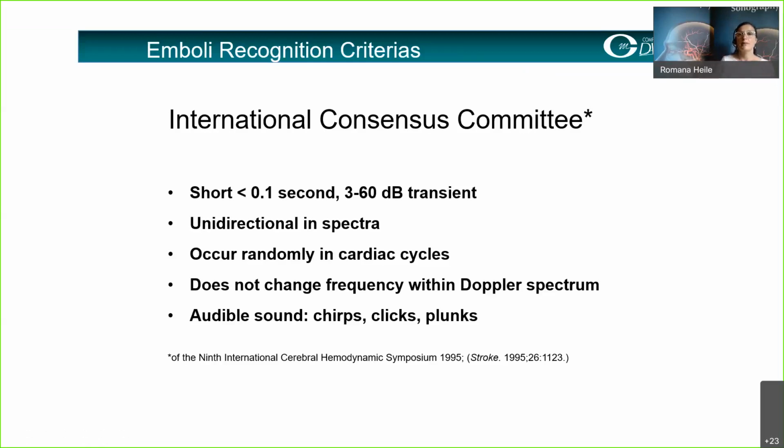So some people, in my experience, say, but if I have so many events, like for instance in a PFO, well, also here, sometimes it's not really necessary to know the exact numbers. If you have a massive shower of emboli, well, even if some of them are not correctly identified as emboli, if you have a shower, you know it's critical.